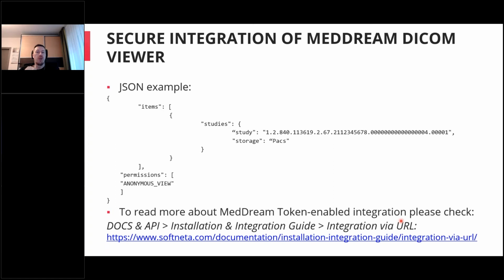And of course, you can always ask our integration team to get in touch with you, and we can help you to configure the token service, and you could try it and implement it in your application as well.